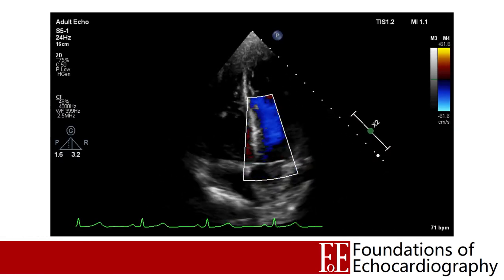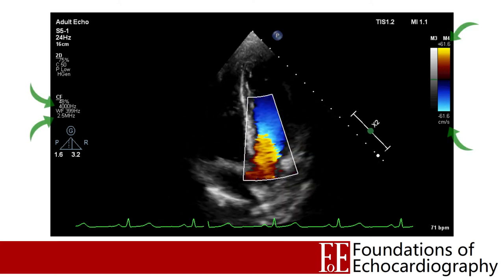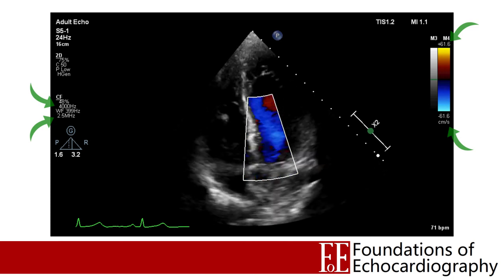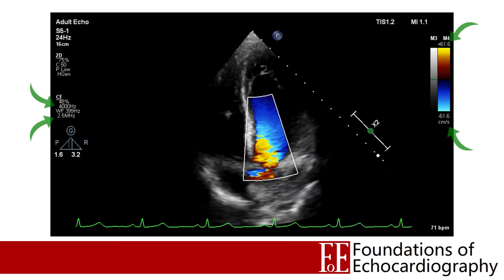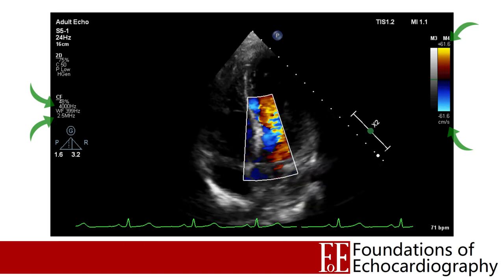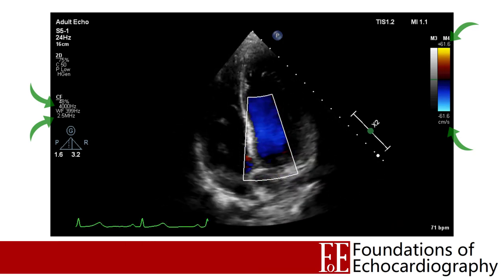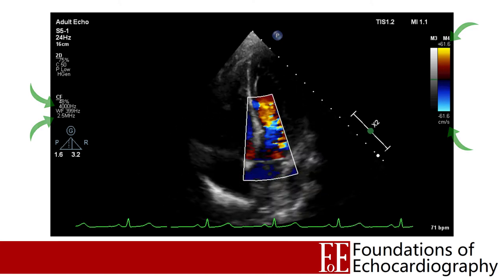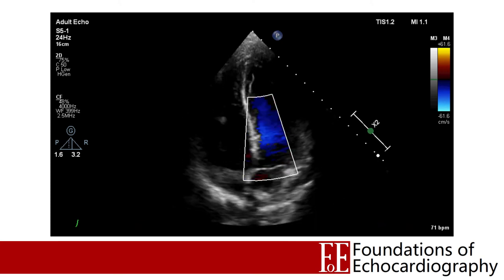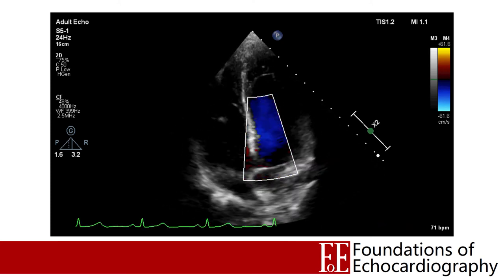Here's another apical 5 chamber view taken from a healthy volunteer. On the left-hand side of the image our transmitted wave has a frequency of 2.5 MHz and our pulse repetition frequency is 4000 Hz. Looking at the scale on the right-hand side of the image, the maximum discernible velocity in either direction is 61.6 cm per second. Let's freeze our image at end diastole and then advance frame by frame, watching the blood as it travels from the left ventricle down into the left ventricular outflow tract and passes through the open aortic valve. This is blood moving away from the probe, so it has a negative velocity and we'd like the ultrasound machine to demonstrate this blood flow using the blue part of the colour spectrum.